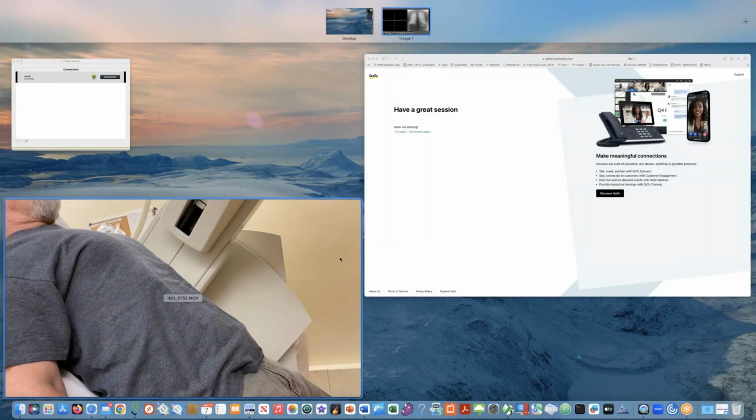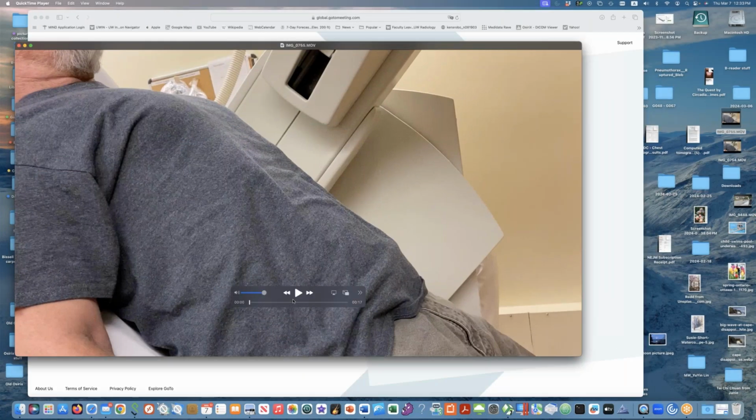It looks quite normal. So here's what the guy looks like. I tried to put him supine. He got desperately short of breath. And so this is the guy at 45 degrees. He was very stoic, and he was very nice to cooperate with this.